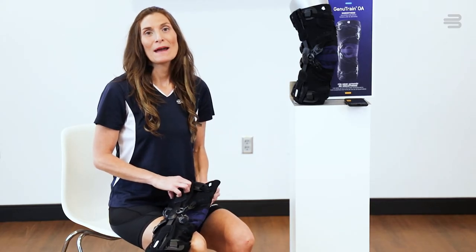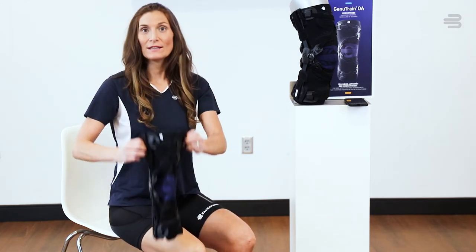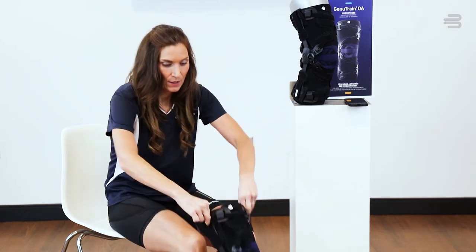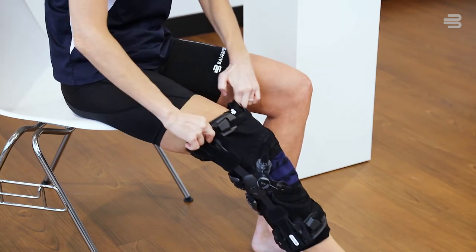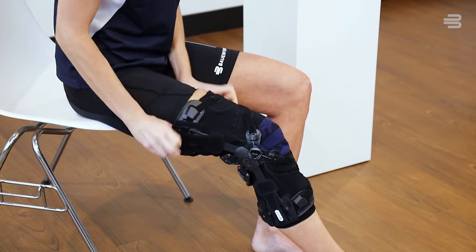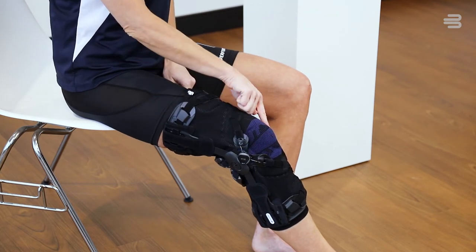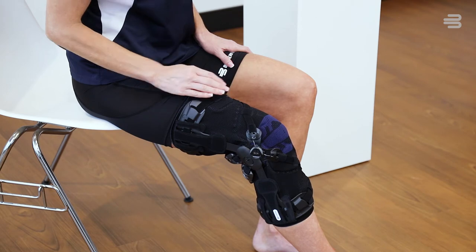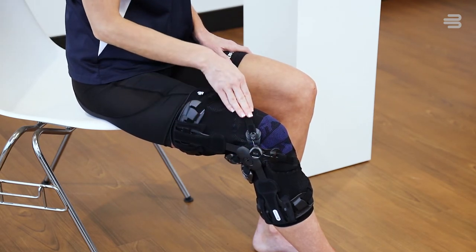To put the brace on, we recommend being seated in a chair with your legs slightly bent. Locate the two donning aids on the side of the brace to help put the brace on. Go ahead and slip your leg through the brace. The center of your knee should be located right on the blue line. To ensure the brace is in the proper position, make sure the C-shape viscoelastic insert is surrounding the kneecap.